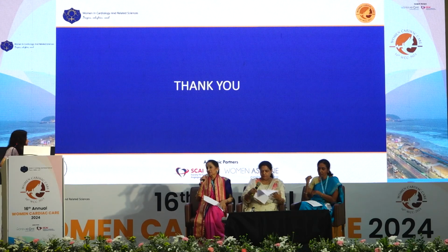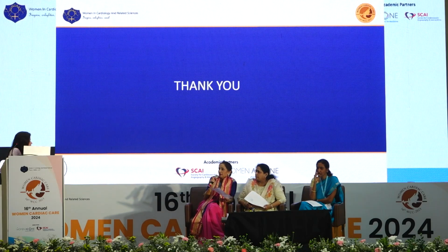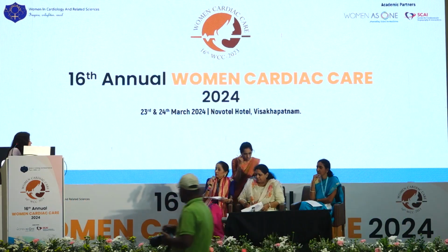Thank you very much, Varsha. That was a very beautiful case, well demonstrated. In fact, in olden days, we were not putting stents for ostial stenosis, especially for Takayasu, because it has more fibrosis compared to other conditions.